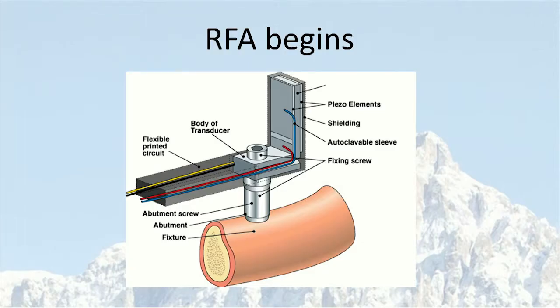And in the first studies we published, we had quite a lot of patients with 5 to 6 implants. So we spent like half an hour, 40 minutes, just to do the measurements in these patients. The principle at that time was to use an L-shaped transducer like this. We have a cantilever beam on the transducer here. And on each side of the cantilever beam, there is a piezo element. By introducing current into the piezo elements, they will bend and stretch. This way, the beam is excited and starts to vibrate.